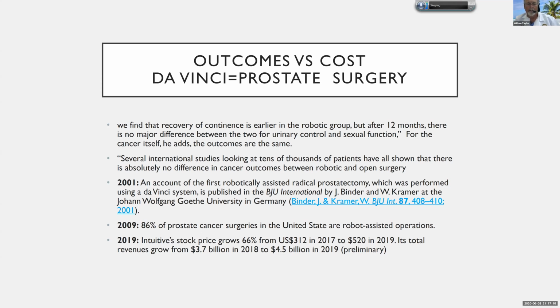The only thing that matters is the experience of the surgeons when they do it. The reality is that this is a marketing system that has increased the hospital's ability to get cases, and it's increased the ability for us to think that we're getting a better outcome with the robot surgery, and that may not be the case. That's a real problem, because I don't know at the moment whether the robot for spine is going to turn out to be the next artificial lumbar disc, or something which is really useful, and I don't think we know at the moment.